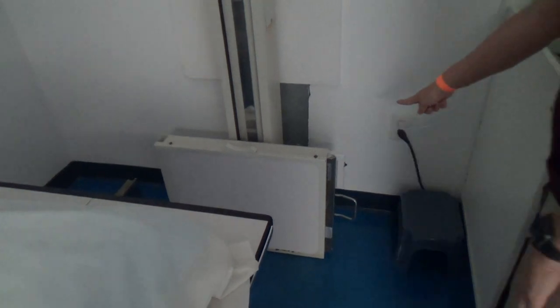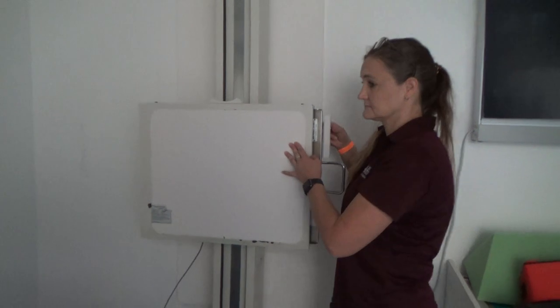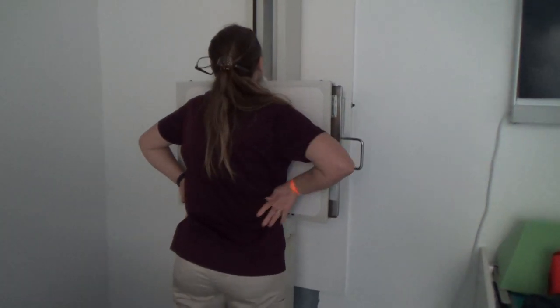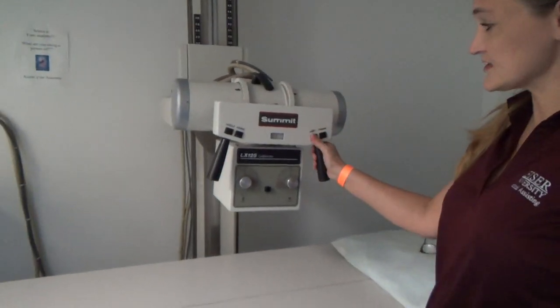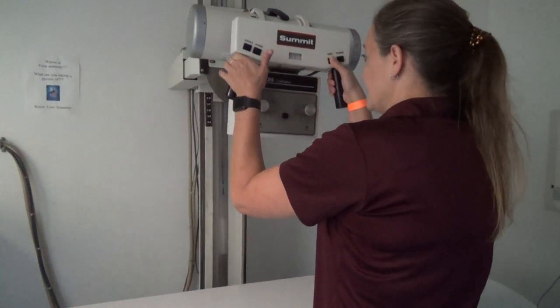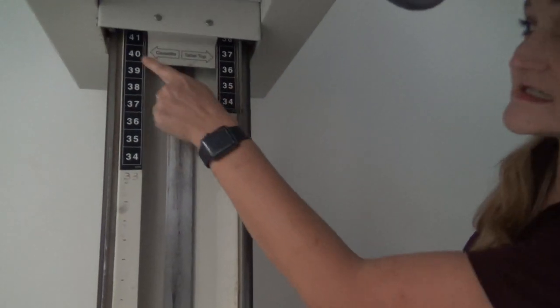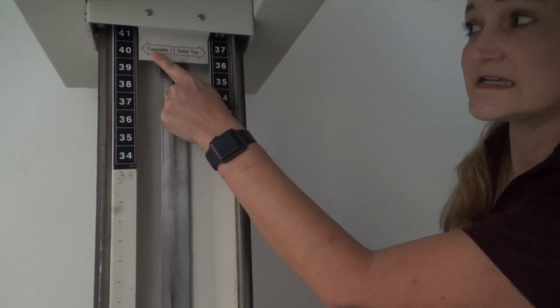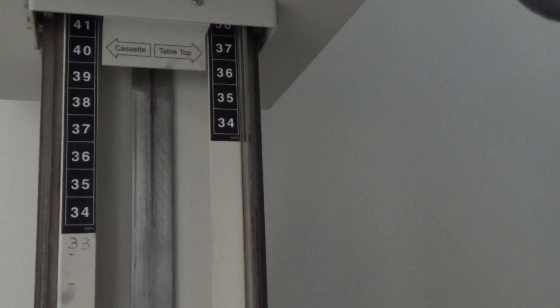You also have an upright bucky over here. There's a little button on the side — same thing, it just slides up so that if you have to get your patient in an upright position, you can do that. For the vertical lock, if you push this button in, this allows you to move your tube up and down. The vertical button is important because this is how you set your distance. For general radiography, we use 40 inches as our distance, using the built-in image detector in the table.